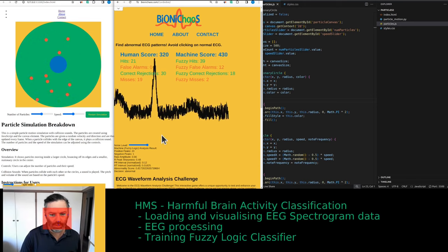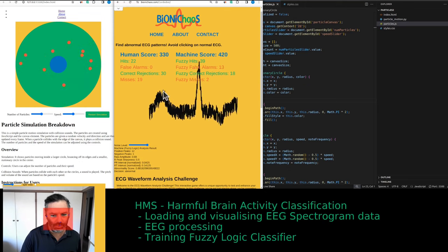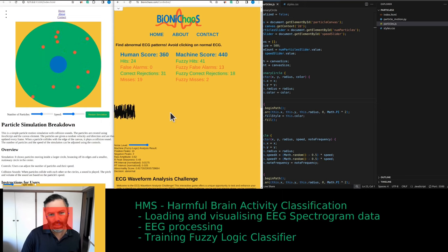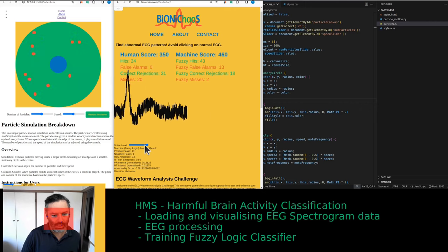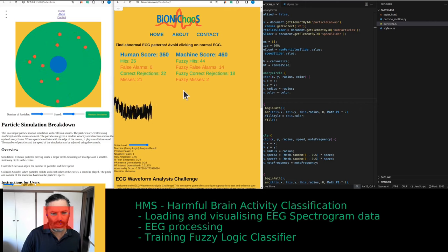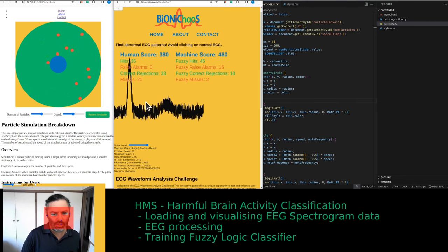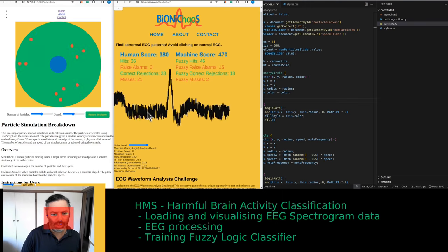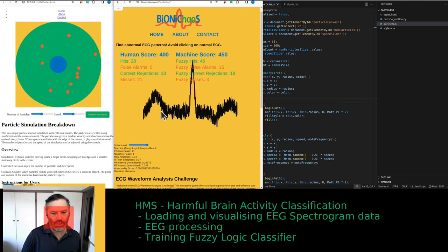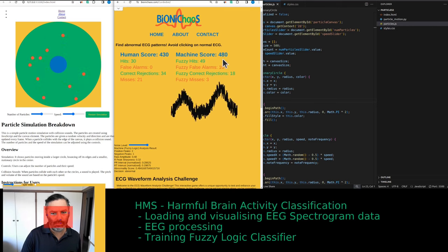If you wonder why algorithms stop working, this is a good tool to explain that — to show what happens in the real world. This is synthetic data, but we simulate all these possibilities. You can see the false alarm rate for the robot keeps going up. As a human, I probably have a chance to match the score of the machine.